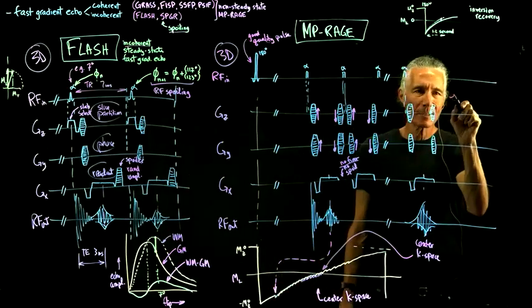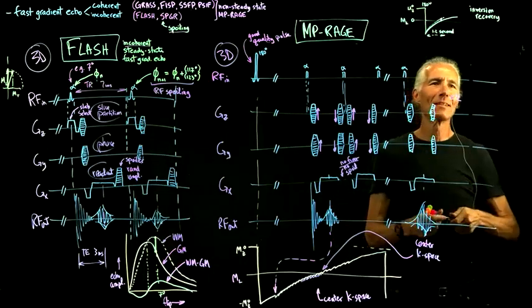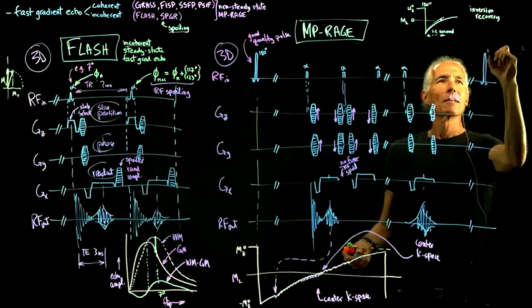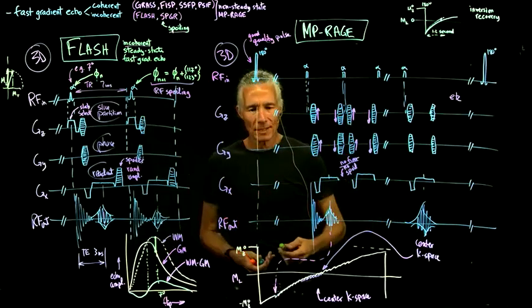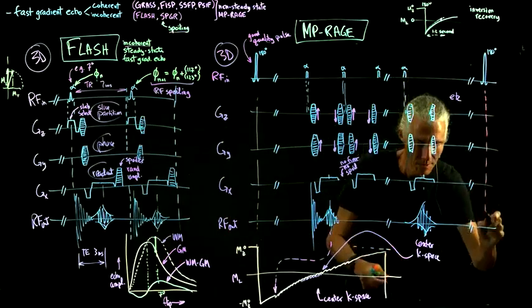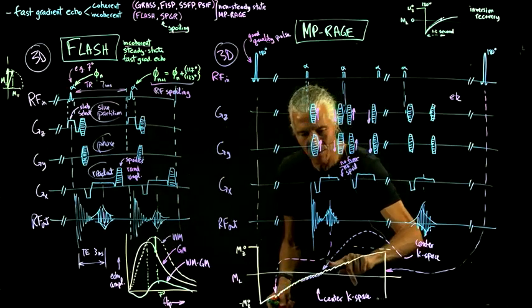But then we're going to collect some more until finally we get back. So there'll be more collection there. You can see the board isn't big enough. And then eventually you get back to another 180. So here's another 180. So the way that this pulse sequence corresponds to here, the way that this is notated in the interface is kind of confusing.